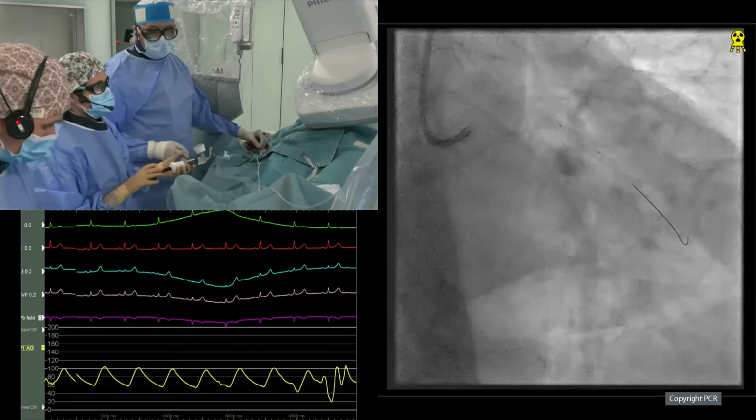Okay, I think the situation is back under control. You pre-dilated. Yeah, you probably noticed that as soon as I did some dilation, there was already flow. So yeah, it's a lot of disruption. Before performing post-dilation, I just crossed with the balloon, brought it back, performed a small injection, and there was flow already.